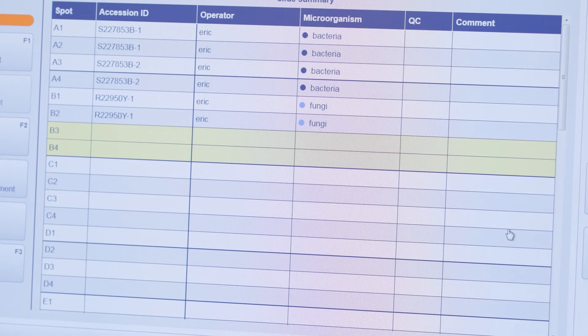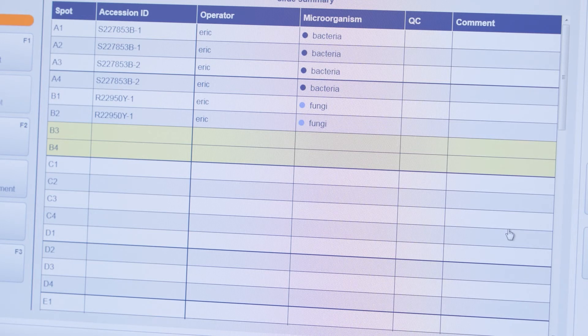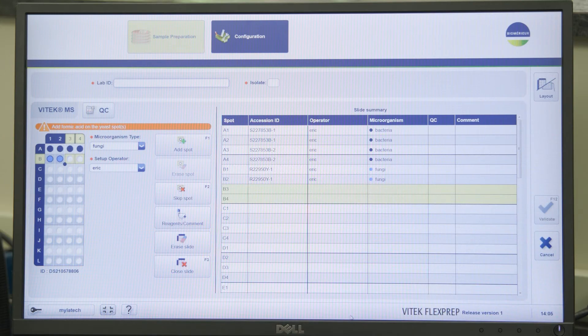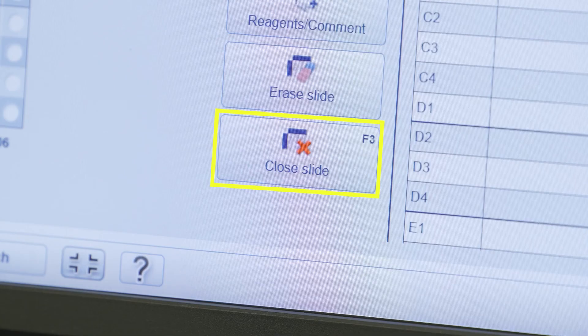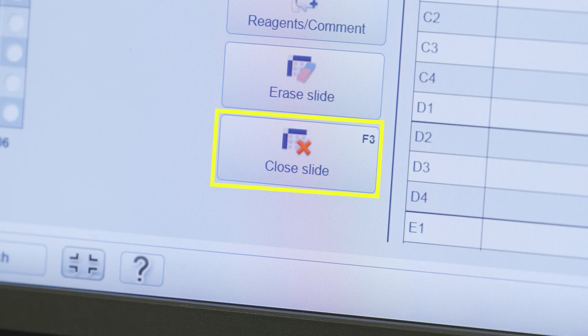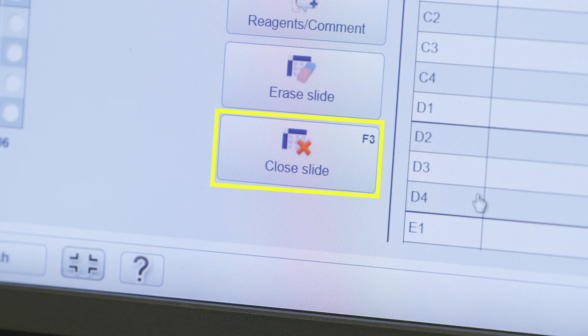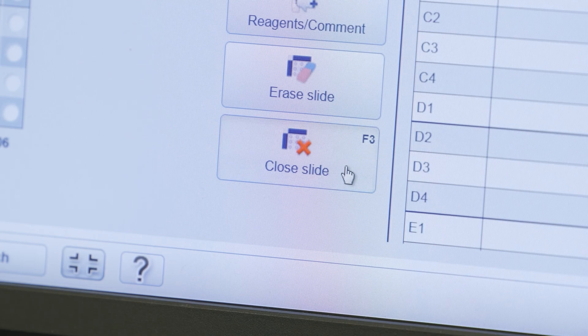The slide summary can be checked to verify accuracy before closing the slide. When all desired spots are linked to a lab ID, click close slide or F3 to exit.